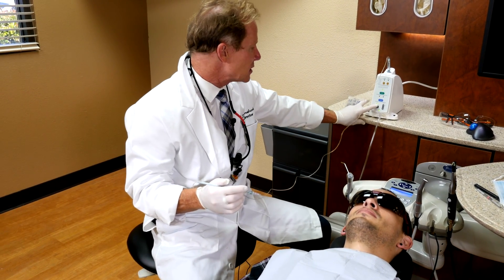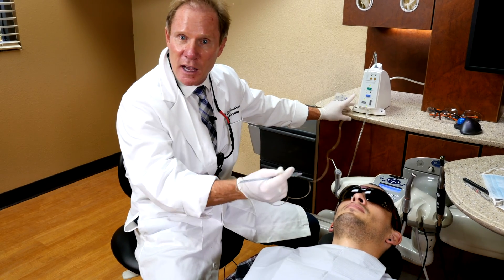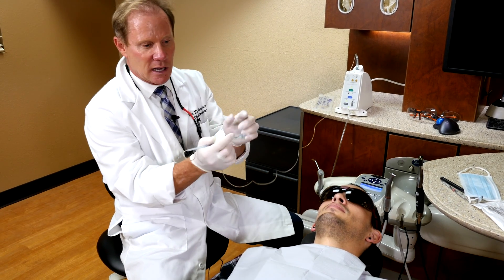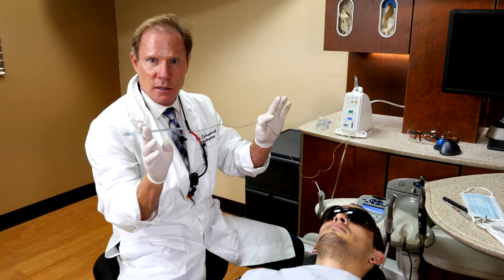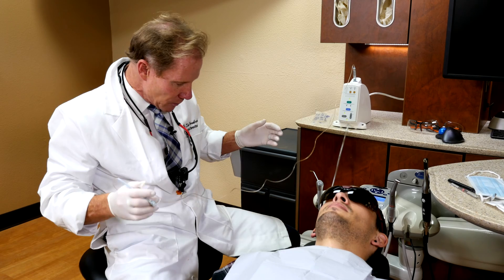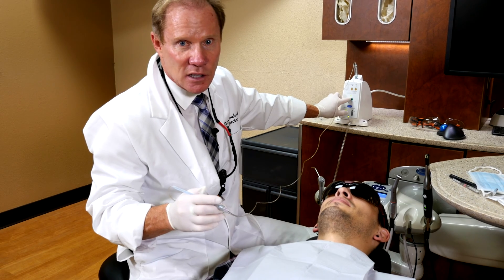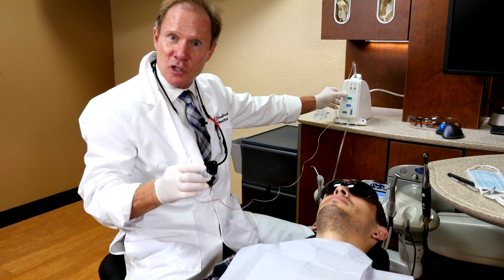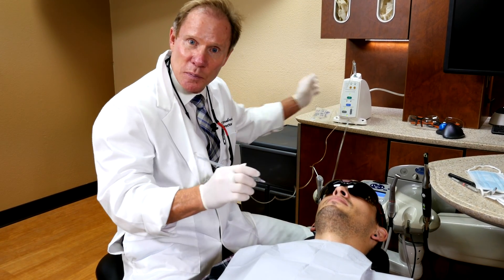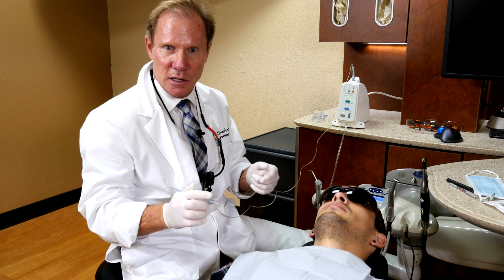We can either aspirate or not aspirate. The nice thing about aspiration is, once I take my foot off the foot pedal — because it is foot pedal activated — as I pull the needle out of the tissue, the aspiration will pull that excess anesthetic that lies in the needle and the delivery wand back, so it doesn't go in the patient's mouth. That single pressure confirms whether you are truly in the PDL space. If you try to give a PDL and you're pushing and nothing comes out, or it comes out very easily, you're probably not in the PDL space.